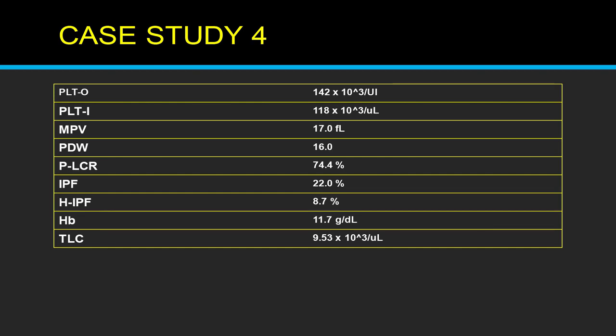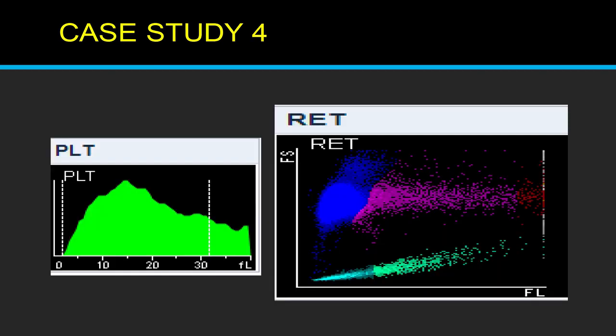So the same biological reference interval in a North Indian population, which is 5 to 7%, becomes about 15 to 20% when you move to Calcutta site. And the high fluorescence IPF was also high, 8.7%. So this is that prototype case.